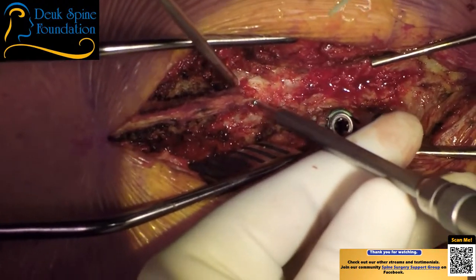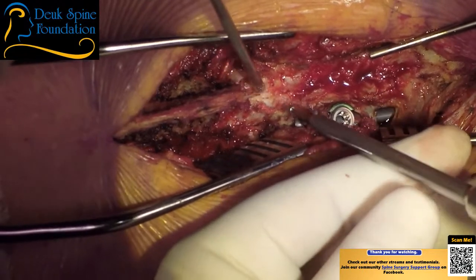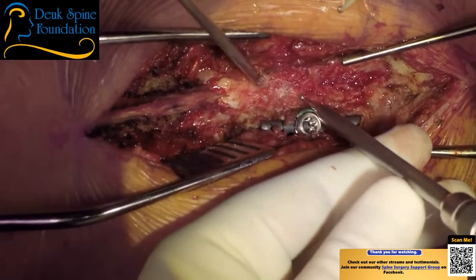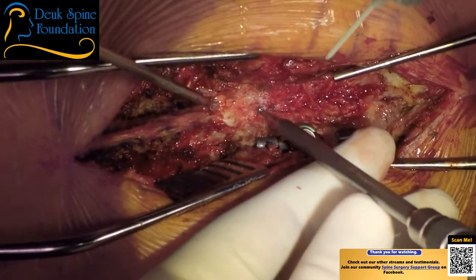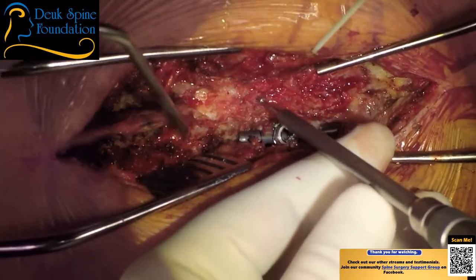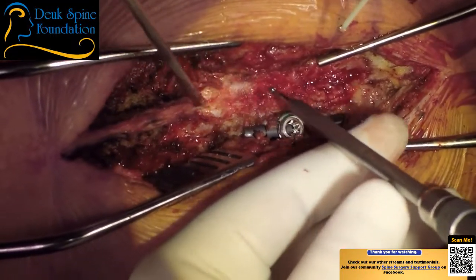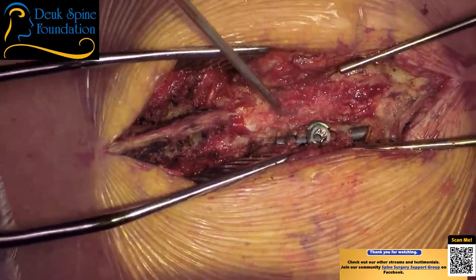But, you know, on the thoracic spine, everything's a bit narrow, and I may just do an onlay fusion here. So let's clean that bone. We're going to go ahead and fuse, but not with instrumentation. I'm just going to do an onlay, unless I think things are stable enough that I can get an onlay fusion. I need you to suck here. Yeah, don't worry about that. Let's get some gel foam.